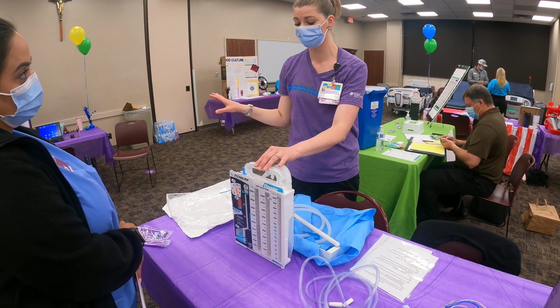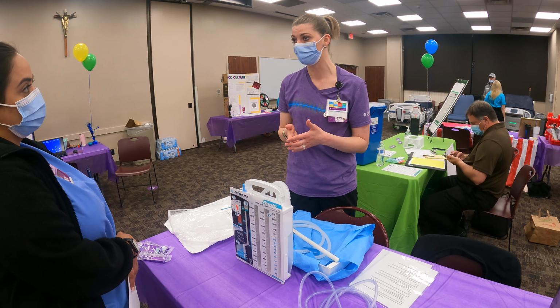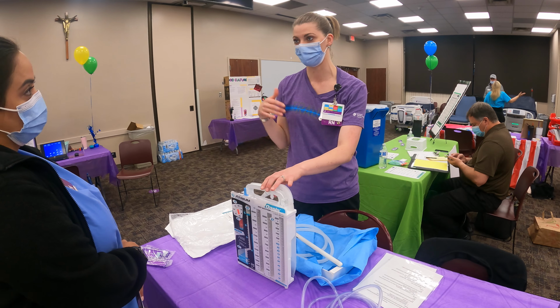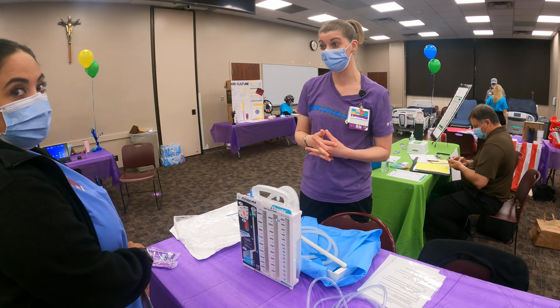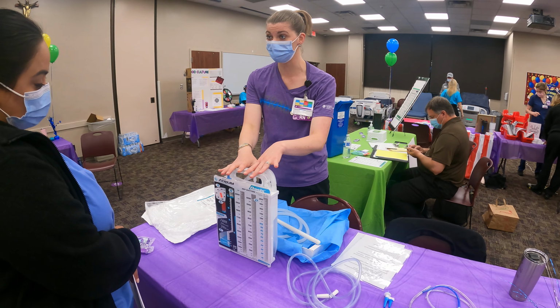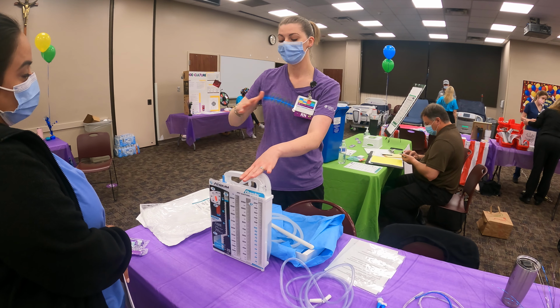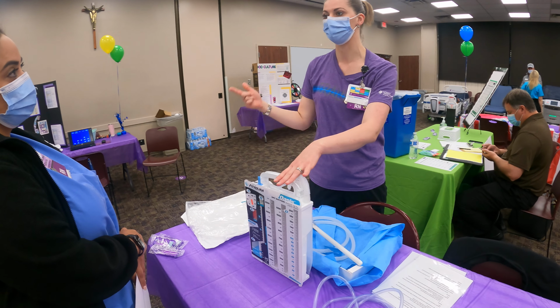In the chart, we want you to record every 4, just like normal, or in the ICU every hour, but we mark on the collection container every 12, so that we have a visual when we walk in. Okay. If they put out more than 200 an hour, then we need to be calling the surgeon and being concerned that they're putting out too much. If you first place a chest tube for the very first time, their output will be higher. Okay. So after the first couple of hours that this is placed, then we worry about that 200 an hour.